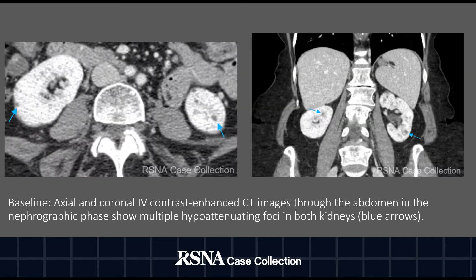The left image is an axial contrast-enhanced CT scan through the abdomen in the nephrographic phase and showcases multiple hypoattenuating foci in both kidneys, denoted by the blue arrows. The same finding is also found in the coronal CT image on the right.